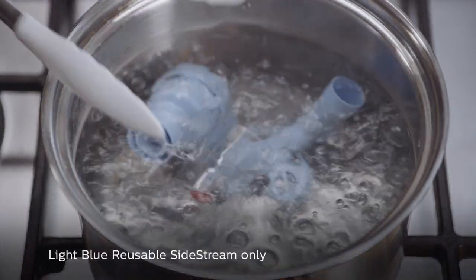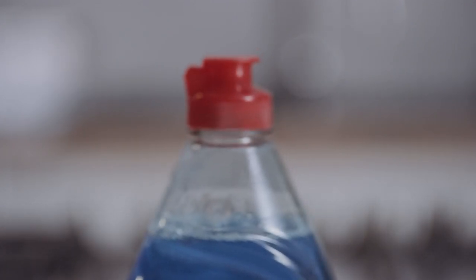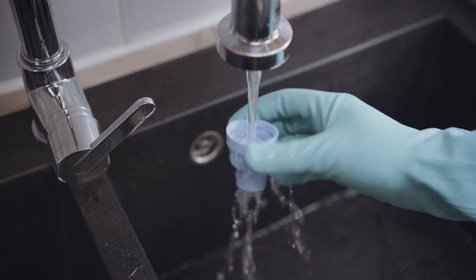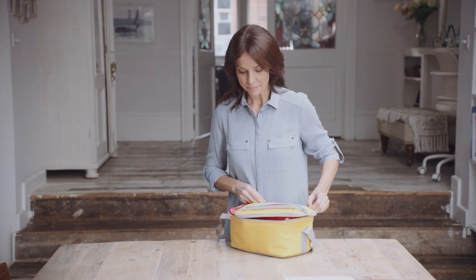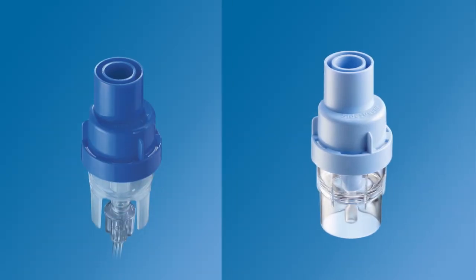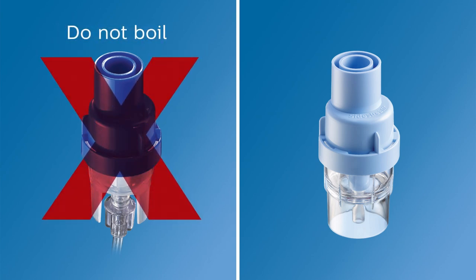Once a week, boil the Sidestream — but not the face mask and tubing — in water with two to three drops of dishwashing liquid for 10 minutes. Rinse all parts of the Sidestream nebuliser cup in clean water for two minutes. Shake off excess water and leave to air dry. Do not towel dry. Once dry, reassemble the Sidestream for storage. If you have a dark blue Sidestream nebuliser, it's disposable and should not be boiled. We recommend that you replace your Sidestream according to your instructions for use.